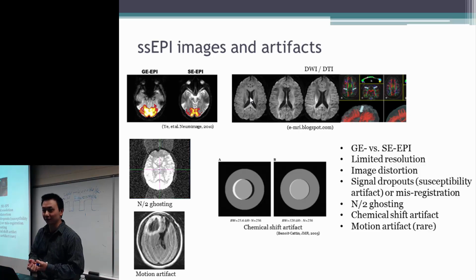Although you say that you have increased the voxel size, it's still very small. It also depends on the strength of the diffusion weighting you are using. It's 2000? Yeah, 2000 is actually a very high diffusion weighting.